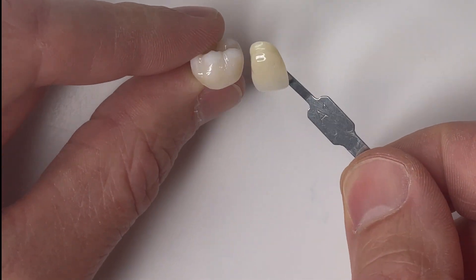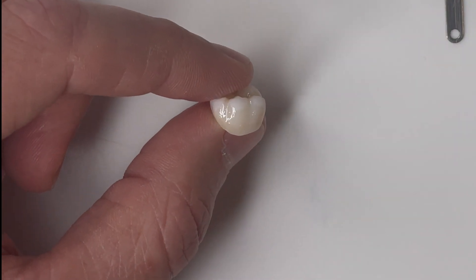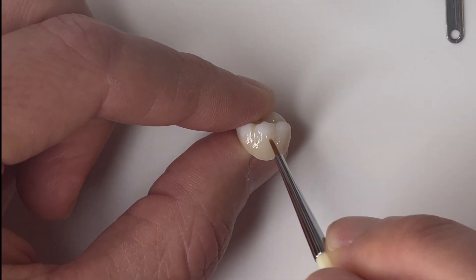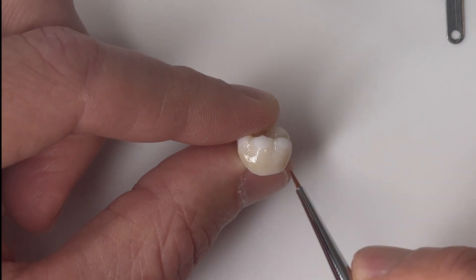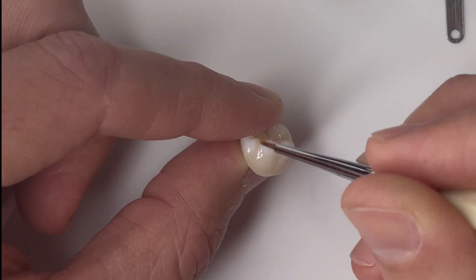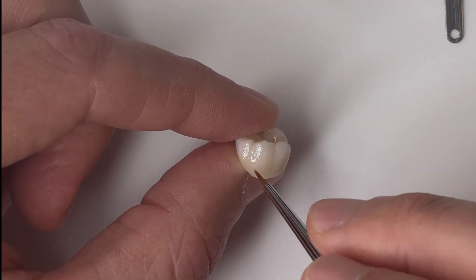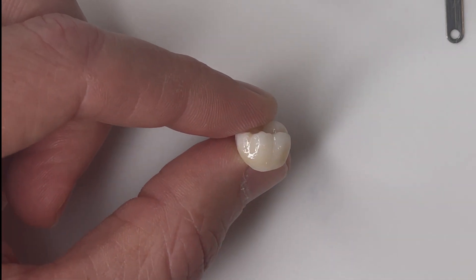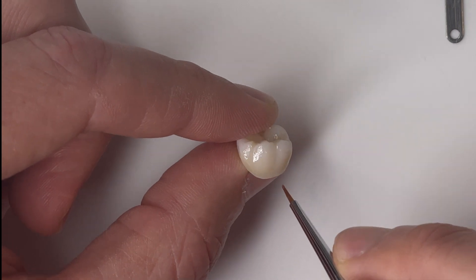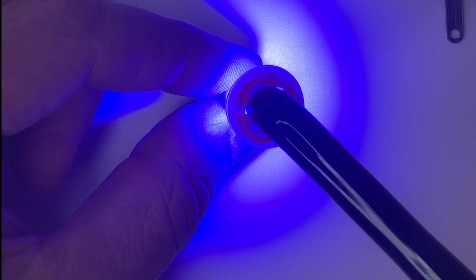Having that shade guide handy means you can check your progress every once in a while. I can see I'm a little bit low in chroma still, so I'm going to go back and add yet another layer. As I start to get close to my intended shade, I'm going to cover the entire crown to make sure we don't have any areas that are too bright. Then going back and adding just a little bit more in that cervical third.